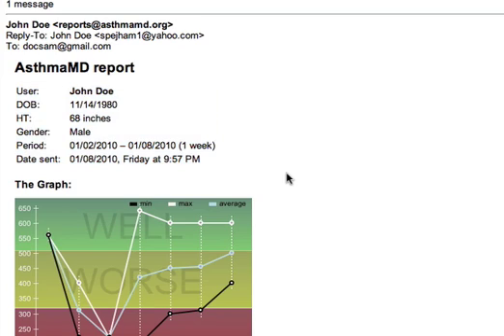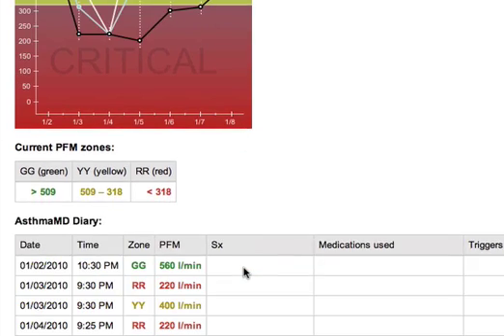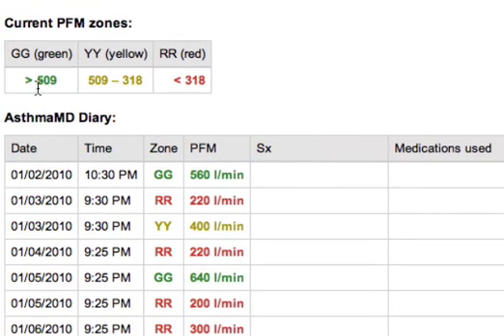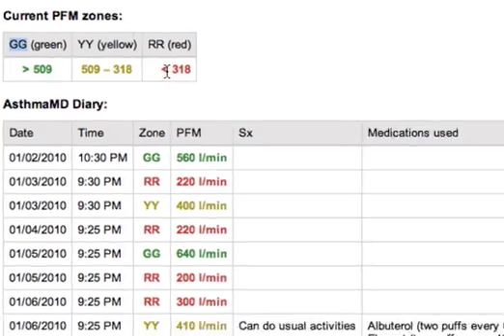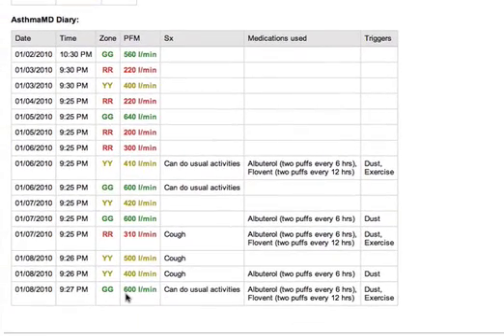The report also includes a graphical representation of your pulmonary function over a period of time of your choosing. It reports all the data points on the graph along with the color associated with your zone color. You can see your current peak flow measurement data, what your color zones correspond to, and which numbers they represent. Below that is your specific data points and times and days that they were measured, along with your symptom score and your trigger points. This is how your physician can be aware of your asthma status to help you better control your symptoms and improve your quality of life.